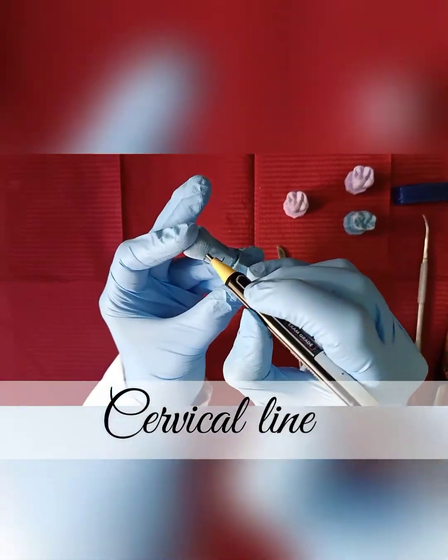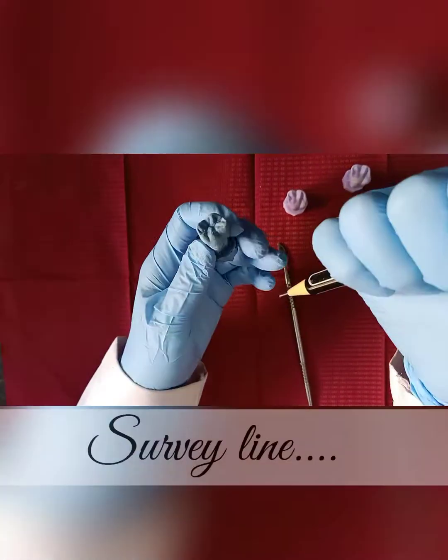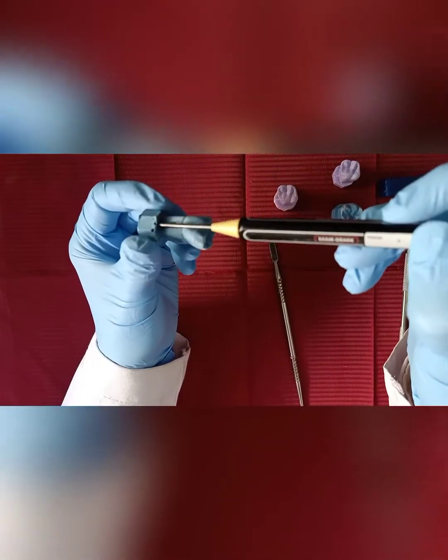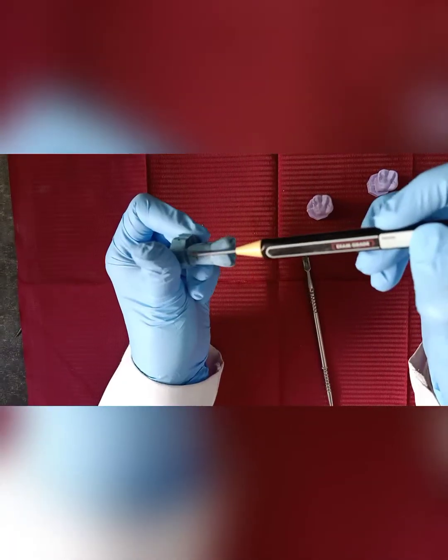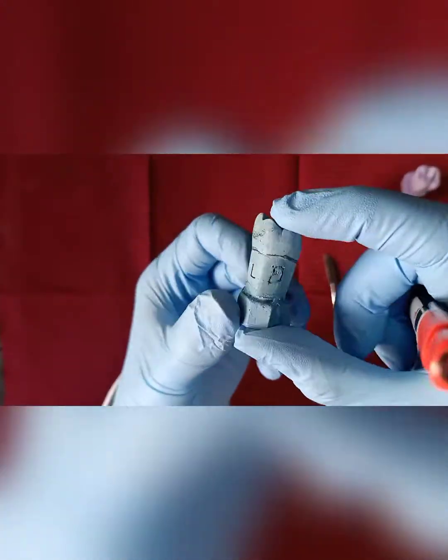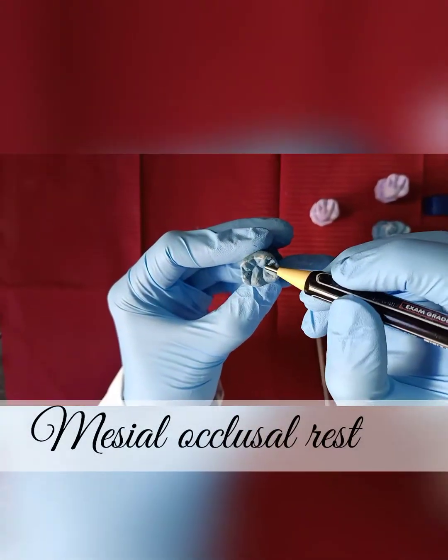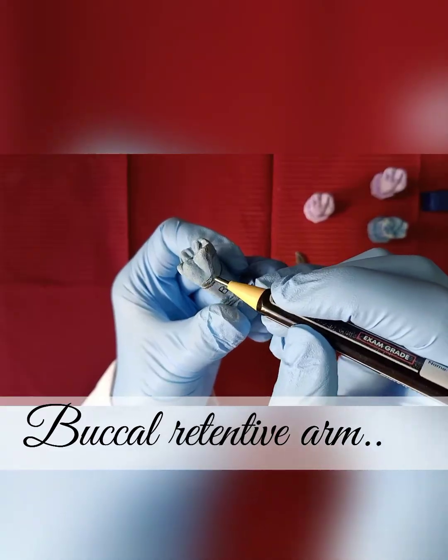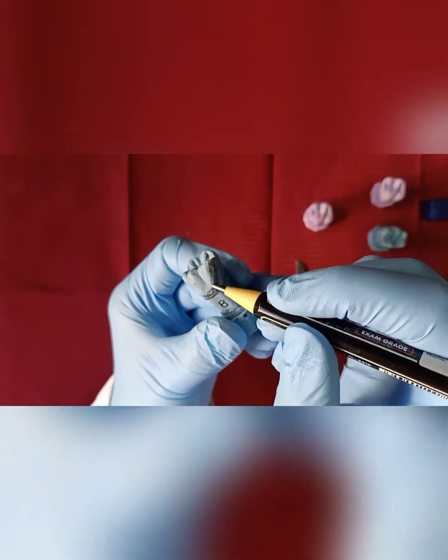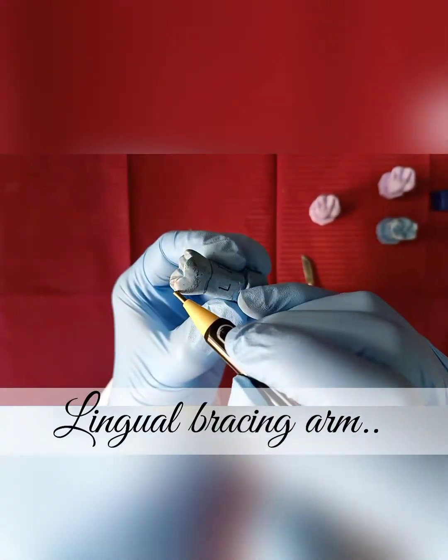For the design of the Akers on the lower tooth, again define all your surfaces, draw your cervical line, and here the survey line on the buccal and the lingual surfaces to define your undercut area. The Akers has a mesial occlusal rest and a buccal retentive arm all above the survey line, only the terminal is below the survey line.